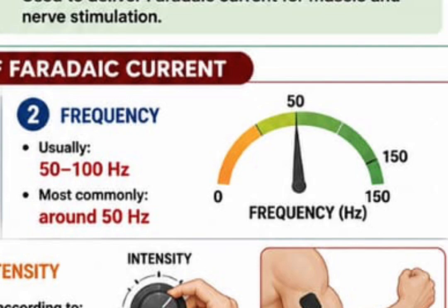Are you getting that? And sometimes when you use a high frequency for a short pulse duration, what happens? You produce a sharp spike pulse. And why it's a pulse is that it is interrupted. You can switch it on for a particular time and off for a particular time. So in the frequency here now, the frequency is between 50 to 100 hertz. But the most commonly used one is 50 hertz. Are you getting me now? So that's for the frequency. Remember, high frequency but for a low pulse duration.